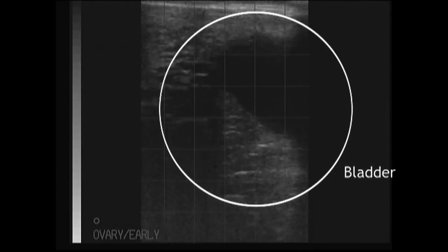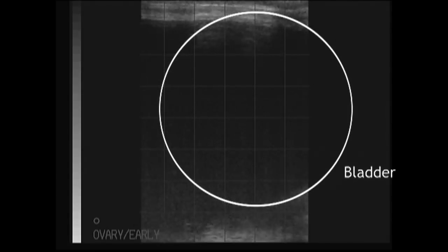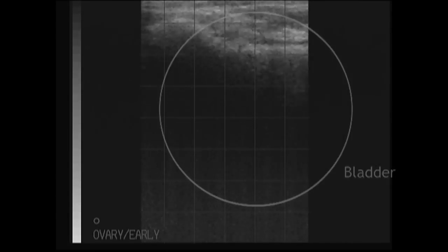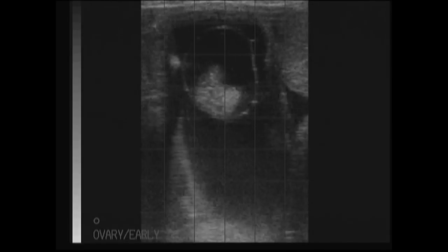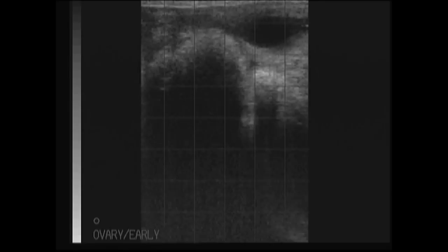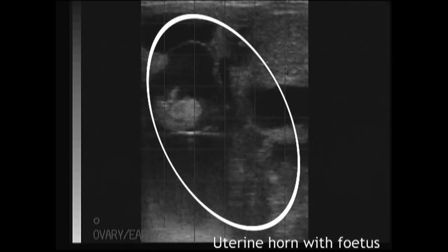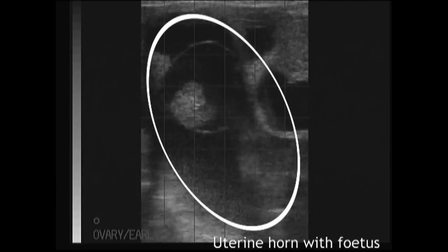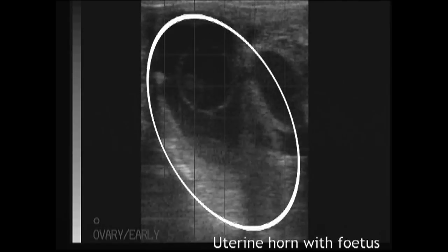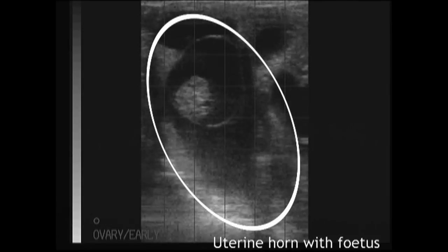We then continue back down towards the bladder, which is now on screen, and back up to evaluate the pregnancy. We can now further evaluate the pregnancy and we see the fetus surrounded by the amniotic membrane. There is a presence of a heartbeat and the size of this fetus indicates that it is 37 days.